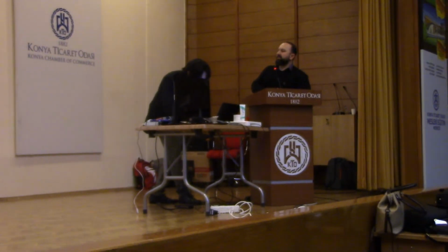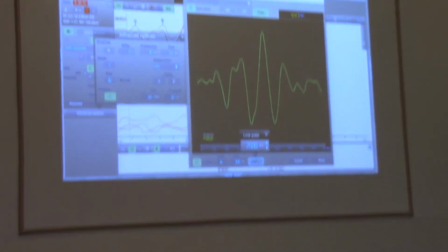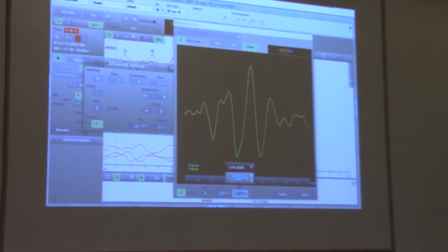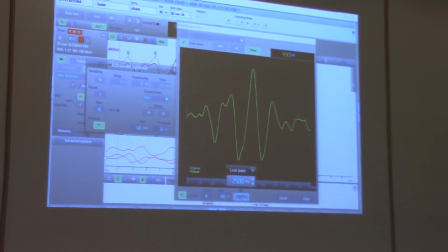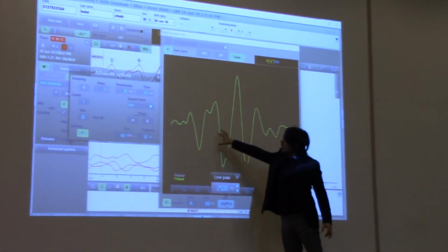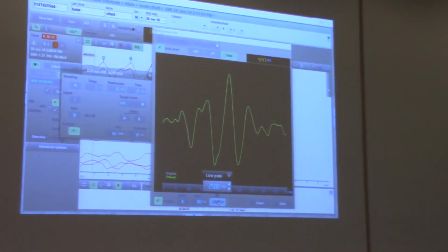Okay, just to show you where is positioned, where is the right position in the frequency spectrum of all the responses, okay, and how to take care about the artifacts accordingly. So here you have the fifth peak, the third peak, and the first peak. Okay, it's clear.